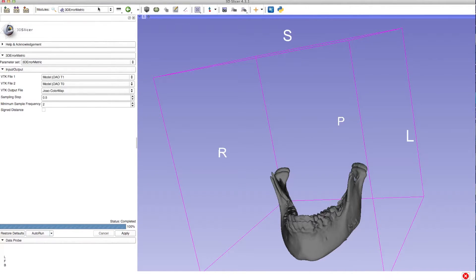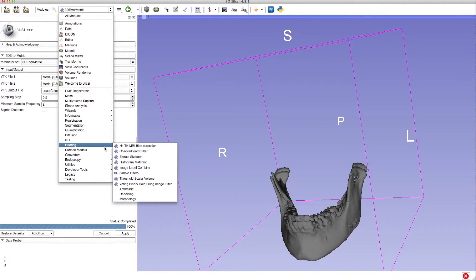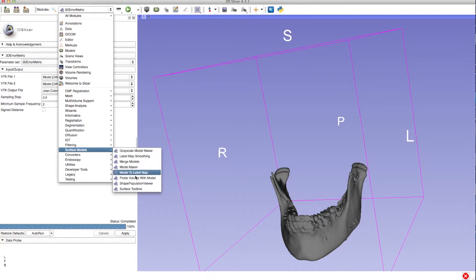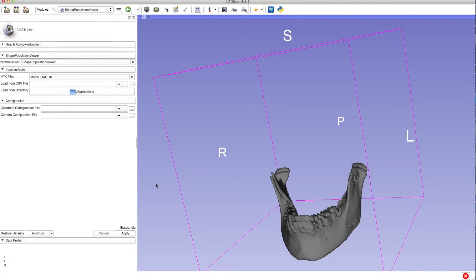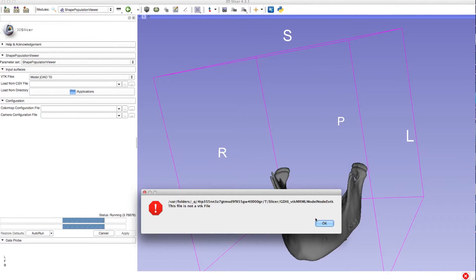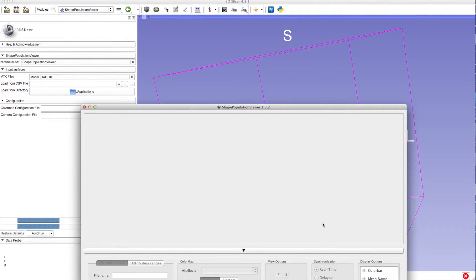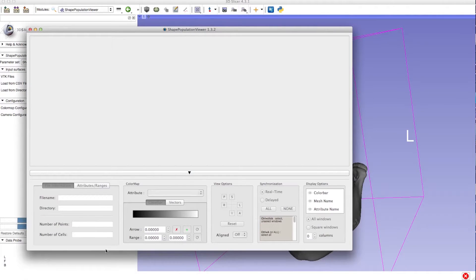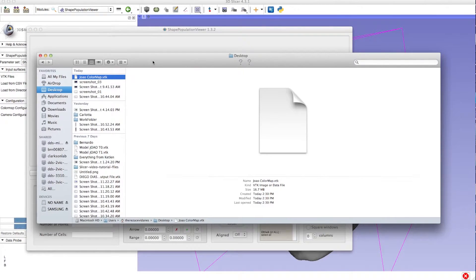After it's been saved, go to the Modules drop down menu, then select Surface Models, then click the Shape Population Viewer model. In VTK files, select at least one VTK file — any of them — and leave everything else as it is. Click Apply, and as it's running, a new window will pop up.